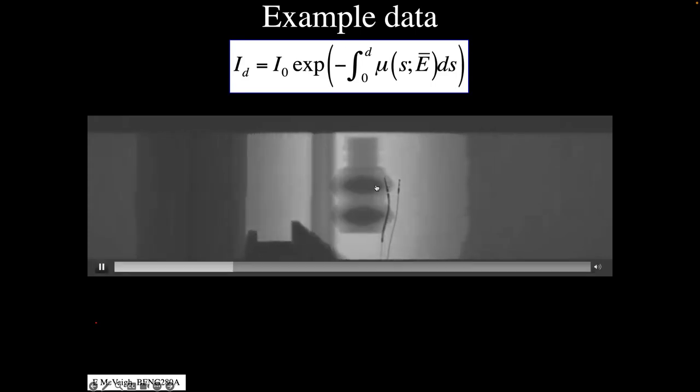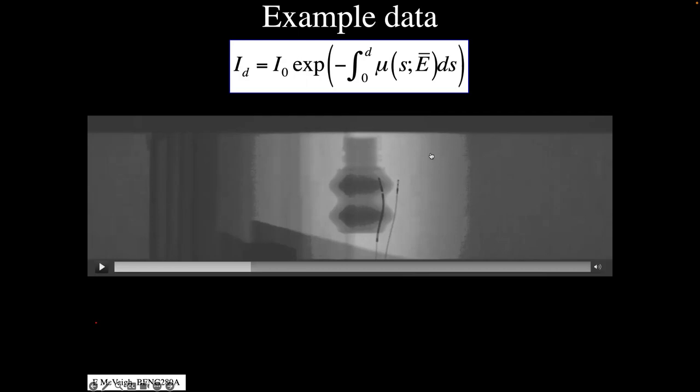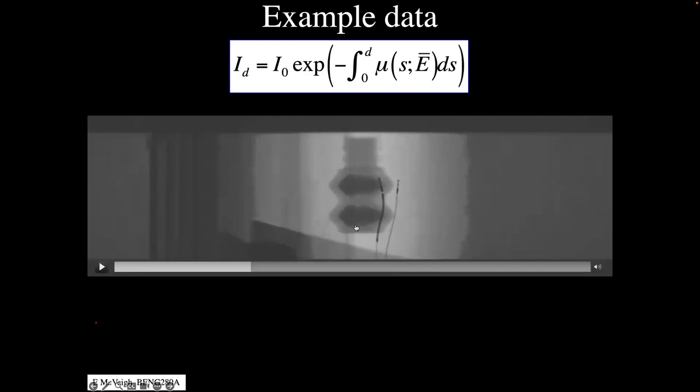And then you can see in the background also, there's this interesting pattern in that there's a bright signal here, which means a lot of x-rays hit the detector right here. And then as I move out to the farther reaches of this detector, the number of x-rays hitting drops off, okay? And this is created by the manufacturer through a thing called a bow tie filter. And it essentially lets more x-rays go through the center of the field of view than out in the peripheral part of the field of view.